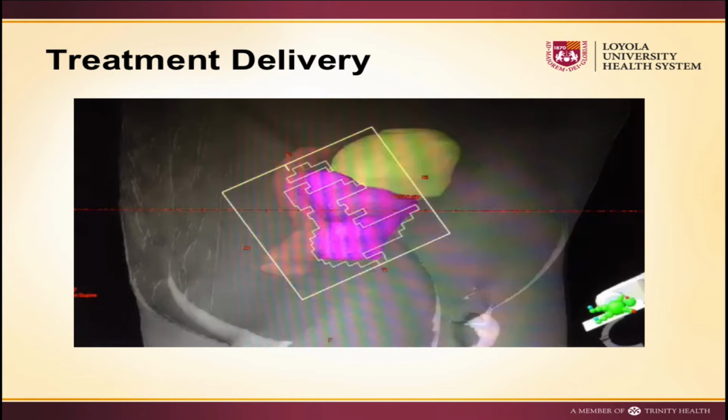So the question is, do we put fiducials in for all of our patients? So right now, I'm more commonly doing the cone beam CT. So we're doing the CAT scan before each treatment as verification of our positioning. But we can.